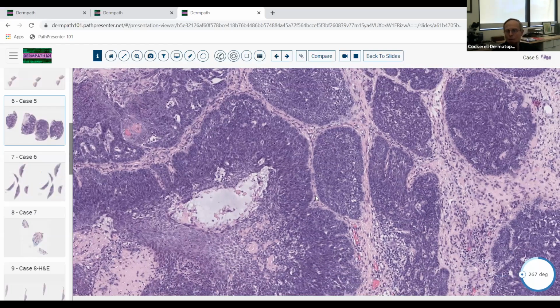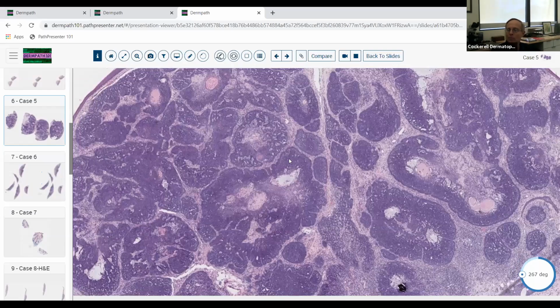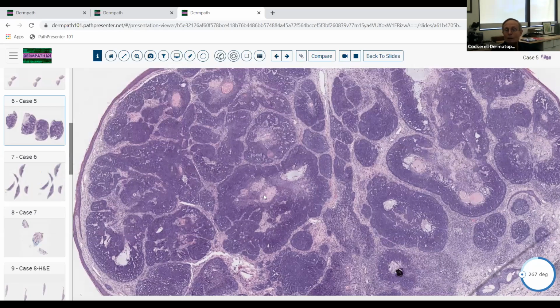So how do you name those lesions? Well, Dr. Ackerman years ago just decided he was going to call basically all of them trichoblastomas. And so this does have a lot of trichoblastic morphology, meaning blast, cell of origin of the follicle. So it's an interesting name, and I think it's reasonable to consider that entity here. If you wanted to segregate this out, you might say, is it a type of basal cell carcinoma with trichoblastic features? Is it just a trichoblastoma? It gets to be more of a semantic issue. So this was diagnosed as possibly a basal cell with trichoblastic features, but it's really more of a trichoblastoma.